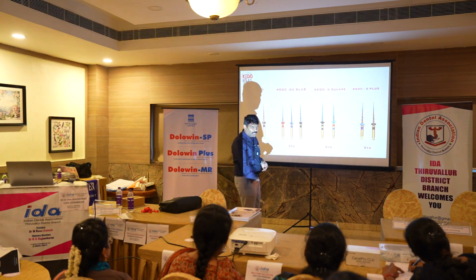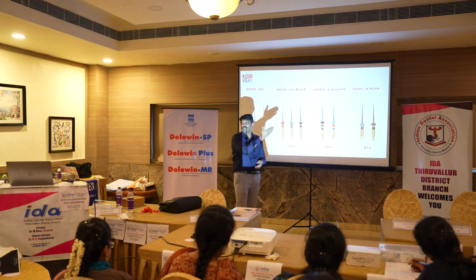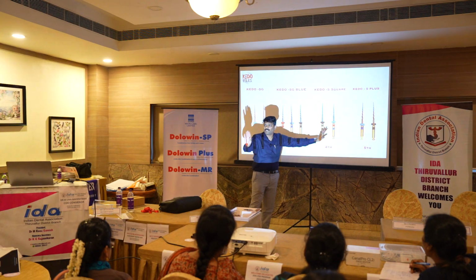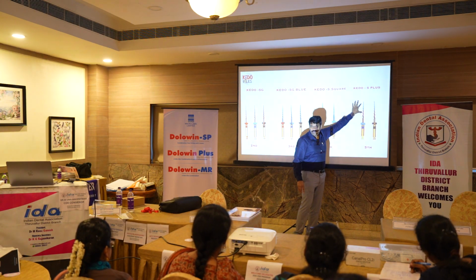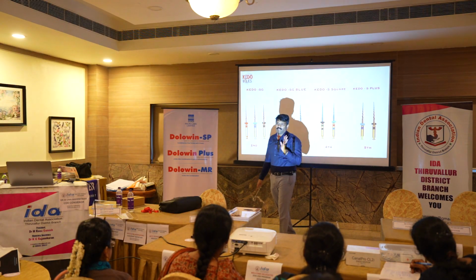As the flexibility of the file increases, cutting efficiency decreases. In permanent teeth, you need cutting efficiency. In primary teeth, you need less cutting efficiency. Here, less preparation apically, but coronally I want a good preparation so that my obturating material flows in. That's why that file is there.